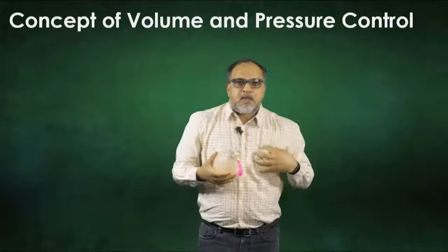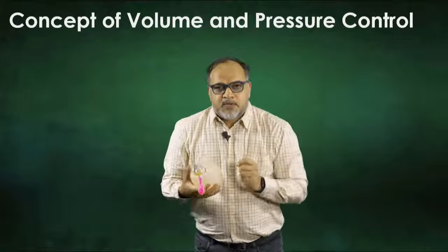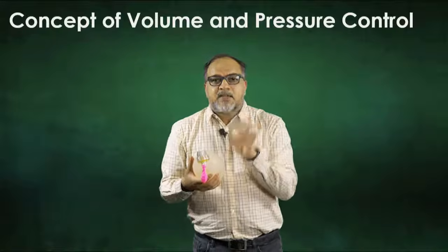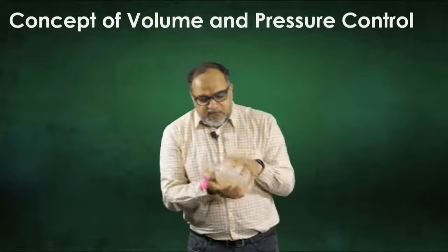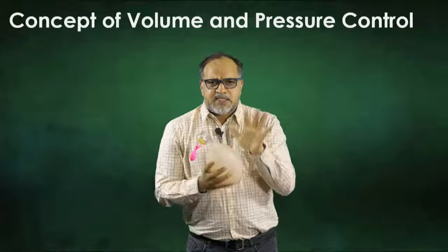Right? So when we come to the concept of volume and pressure control, we can control only one thing. Either we can control the volume or we can control the pressure. Let me explain more. Whenever I am pressing this ambu, this balloon is getting tightened. This much you know.